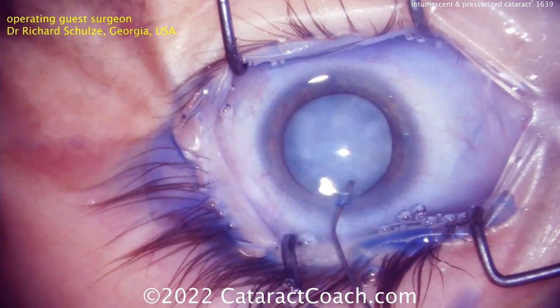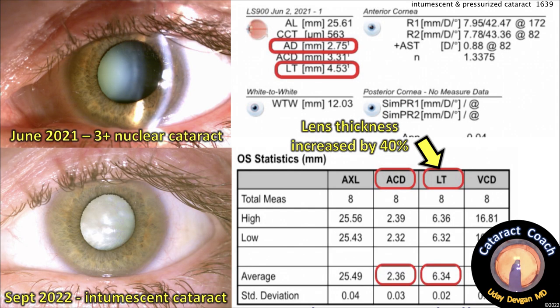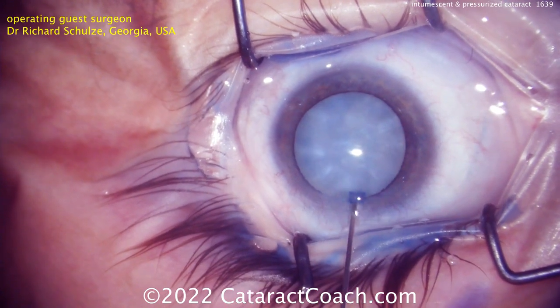We've talked about needle decompression, double rhexis, and femto — none are perfect. Looking at the biometry: back in June 2021, a three-plus nuclear cataract showed good measurements via optical coherence biometry, with lens thickness of 4.53 millimeters. Now, more than a year later in September 2022, it's an intumescent white cataract. The AC depth got shallower, but lens thickness increased dramatically — by 40% — from four and a half millimeters to almost six and a half millimeters. That is a highly pressurized capsular bag.